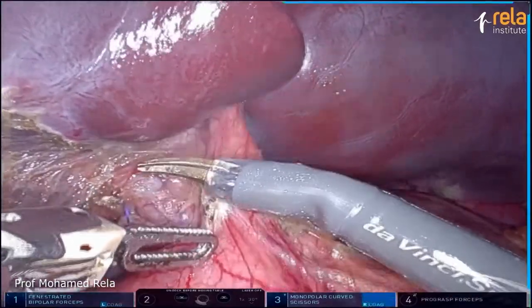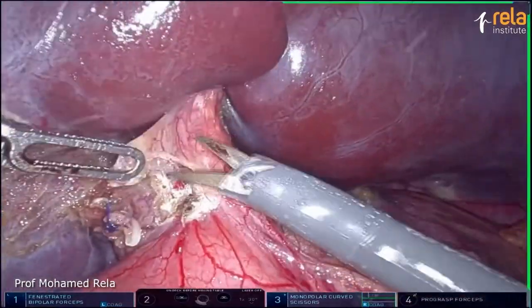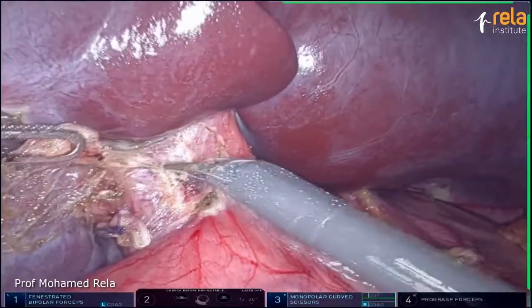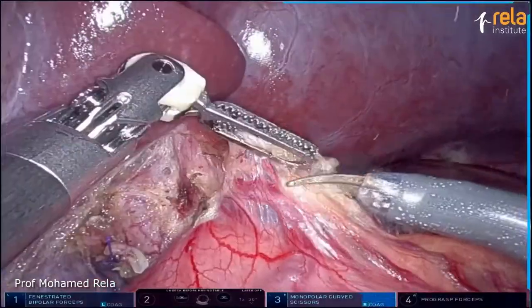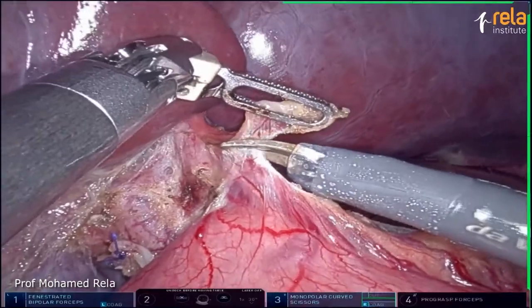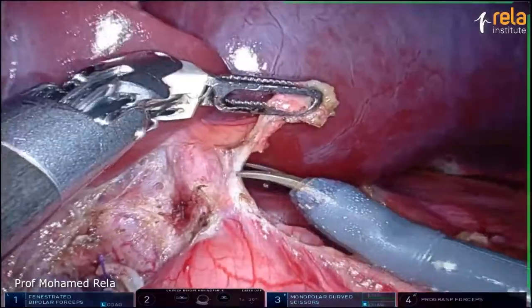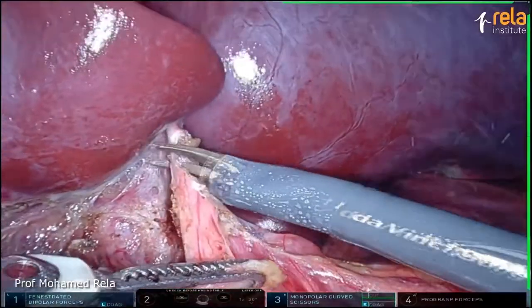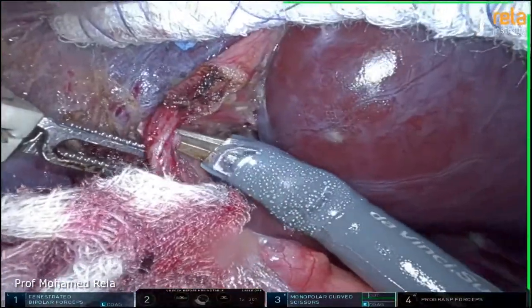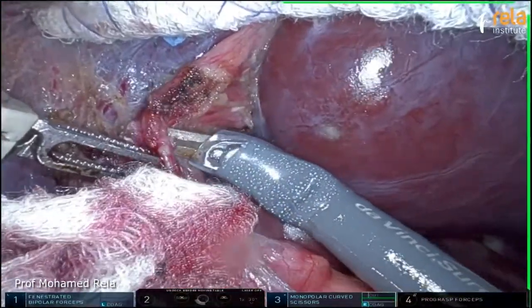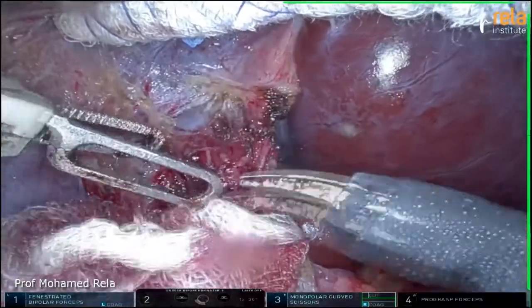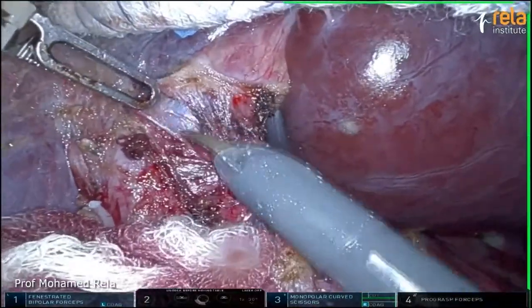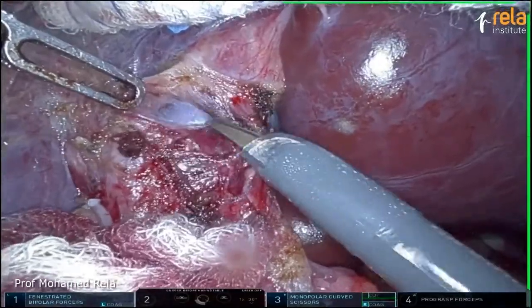Back at the hilum — the left hepatic artery. The peritoneum in front of the left hepatic artery is being cleared. I excise tissue so it's not just hanging around. That's the left hepatic artery, which is skeletonized. We'll pass a sling in a minute. There's some tissue in front of the left portal vein — just isolating the left portal vein.